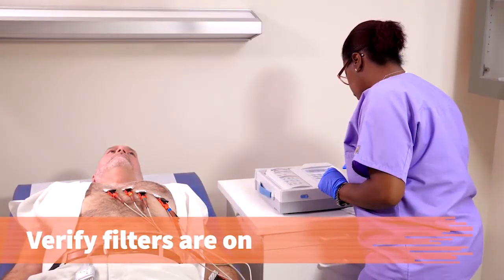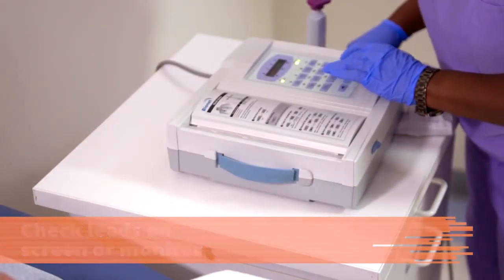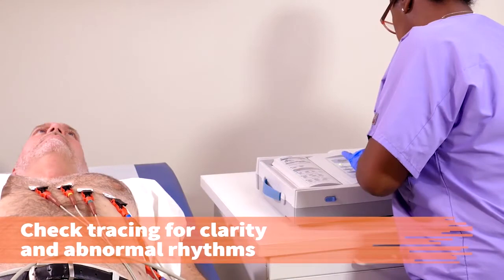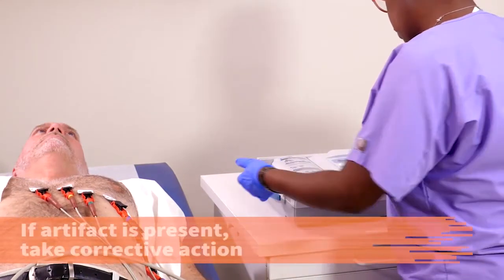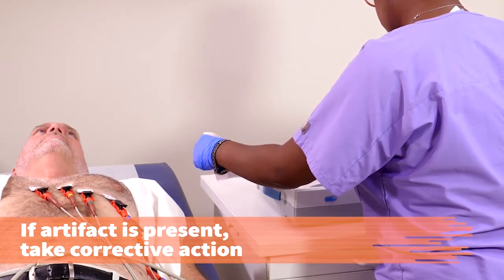Verify the filters are on. Check the leads on the screen or monitor and take any corrective action necessary. Run each electrode when the leads look clear and are without artifact. Check the tracing for clarity and abnormal, life-threatening arrhythmias. If any artifact is present, take corrective action to minimize artifact and run another tracing.